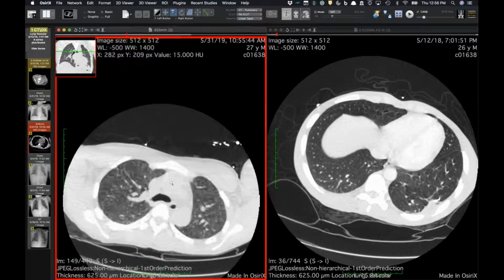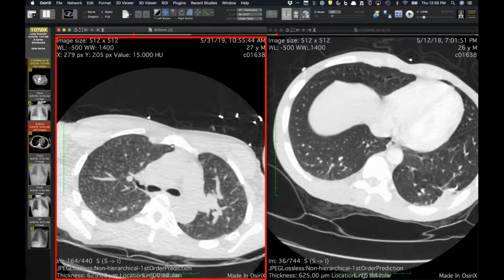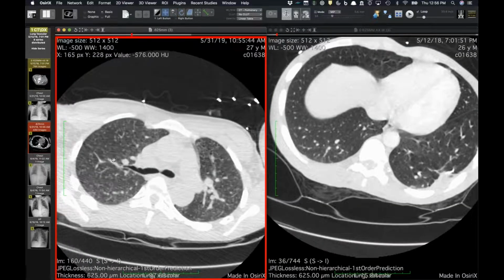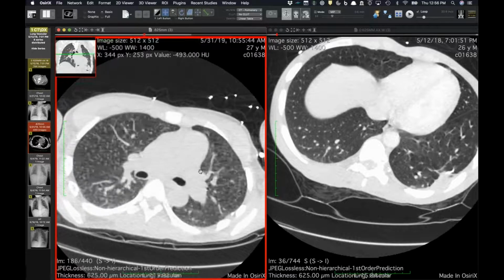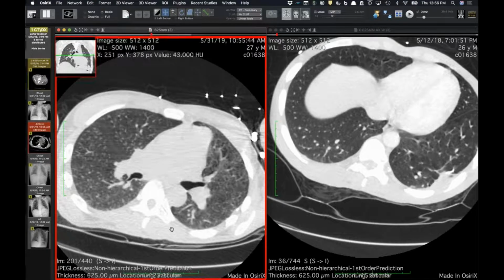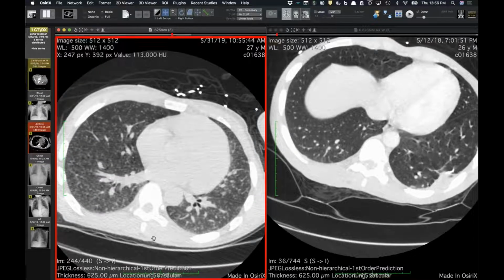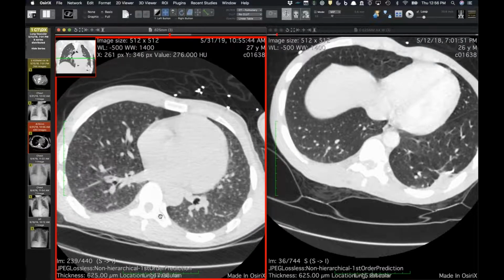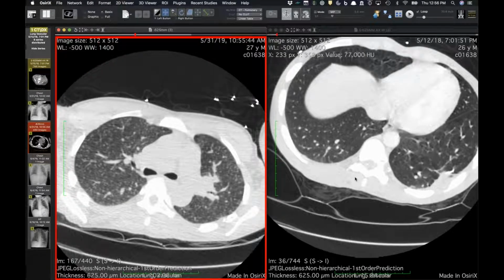So we called up the clinical team and rather matter-of-factly told them we think the patient's injecting. And the clinician said, well, that makes a lot of sense because he had infected lines but was refusing to have his line taken out, for the obvious reasons that he was injecting crushed up tablets. And so they did find that he had syringes and crushed up oxycodone in his room that he was injecting. So it was another excipient lung case.